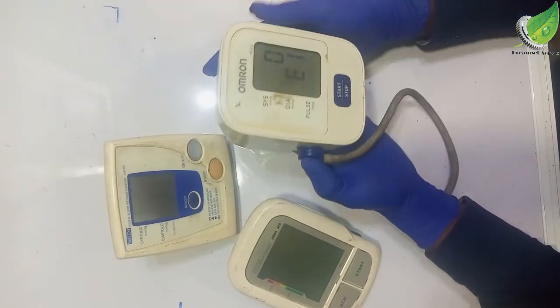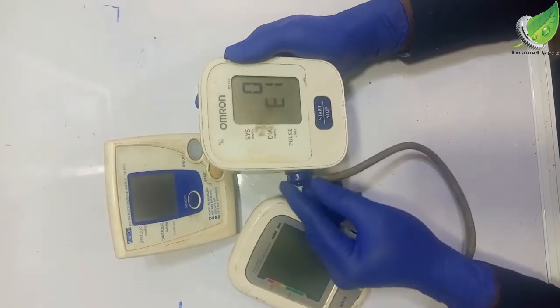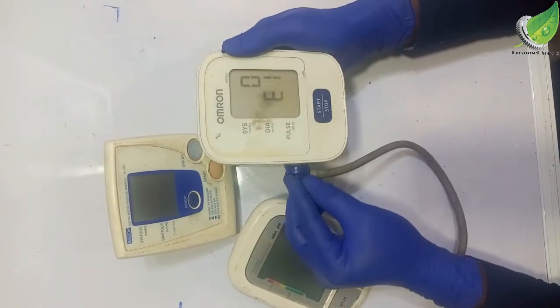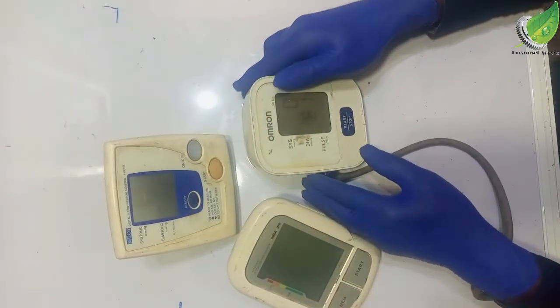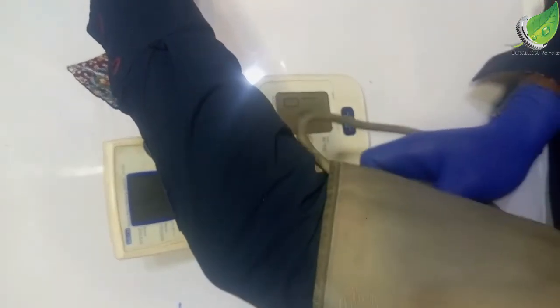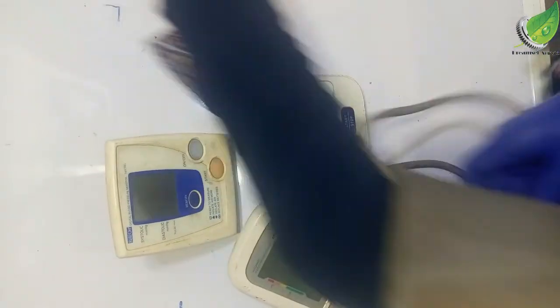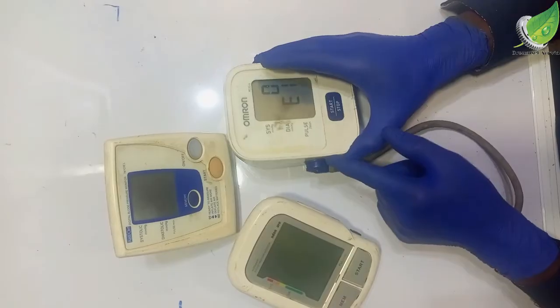So another thing you should check is if the hose is properly plugged into the monitor. Ensure that this is not loose. If this is loose, it's going to give you error E1, and then ensure that this is not loose also, that it is properly plugged in.